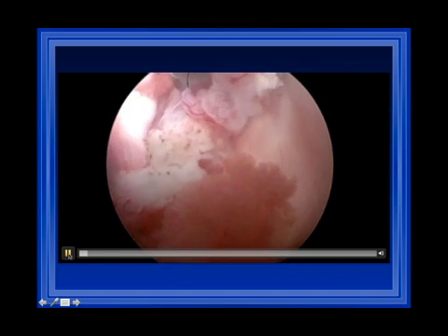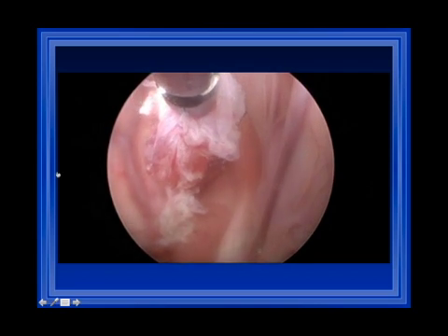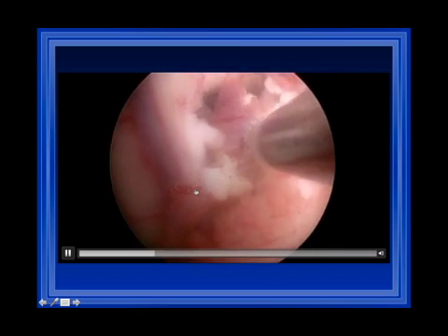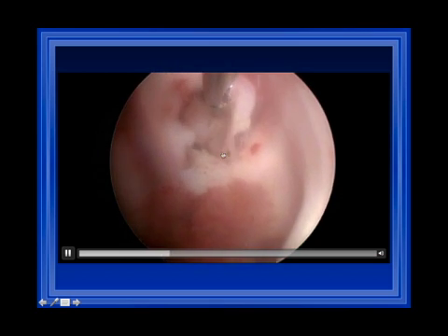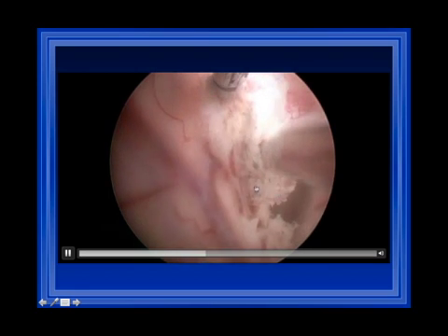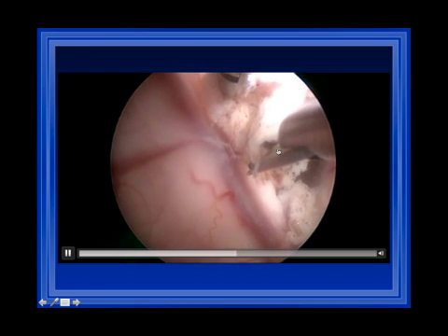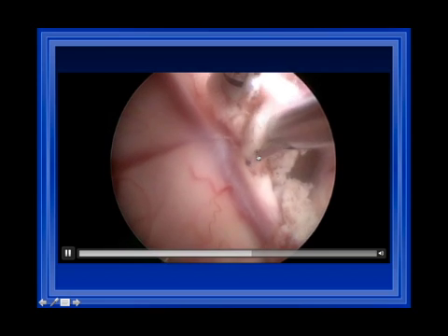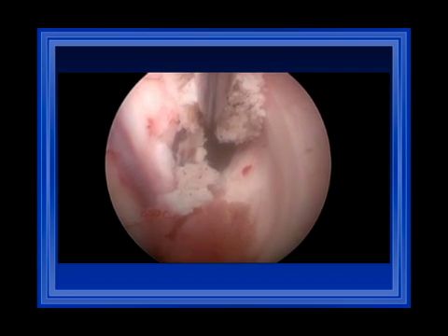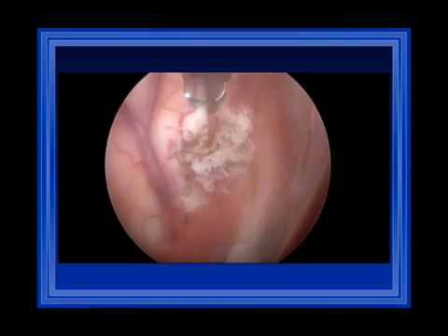A short video demonstrates resection of a colloid cyst and the use of bimanual dissection. First the cyst is mobilized into the lateral ventricle — you can see the pedicle here. If you let the cyst fall down you have no control of the pedicle, so we use the flexible grasping forceps to elevate the cyst slightly, gaining access to the pedicle. We then introduce the bipolar rod and scissors via the main channel to cut the pedicle without pulling. Simply pulling on these cysts usually results in significant venous hemorrhage, so it is much safer to have good access to the pedicle before removing the whole cyst.